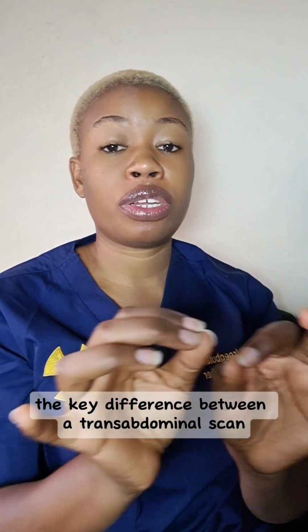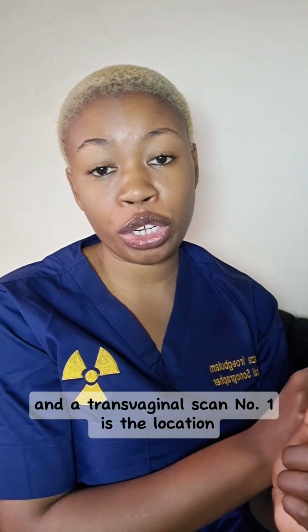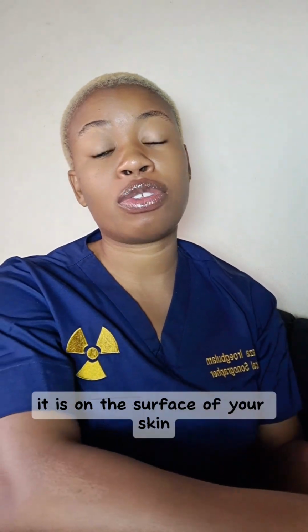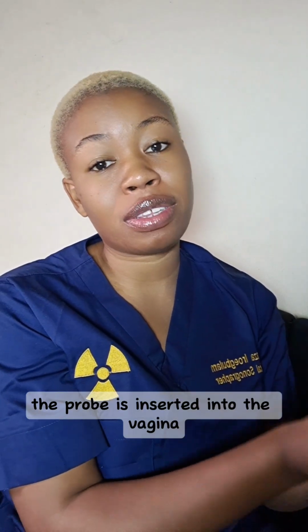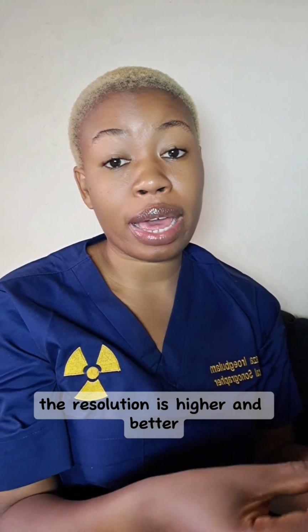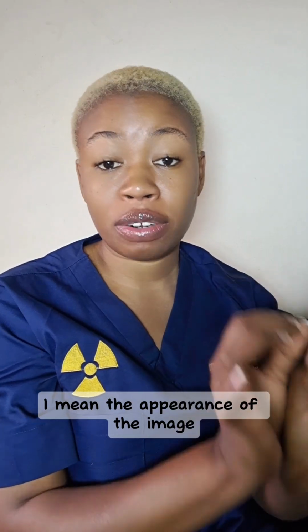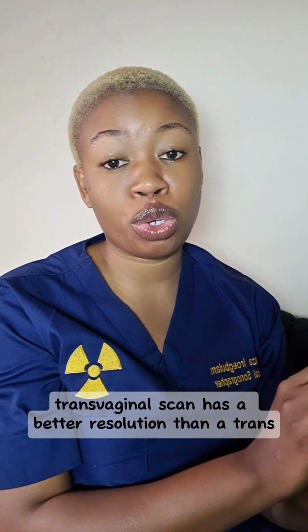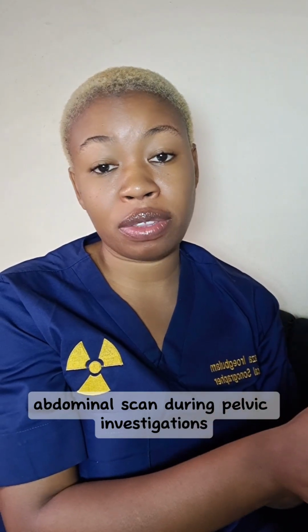So in summary, the key differences between a transabdominal scan and a transvaginal scan: number one is the location. For a transabdominal scan, it is on the surface of your skin. For a transvaginal scan, the probe is inserted into the vagina. The second difference is the resolution. For a transvaginal scan, the resolution is higher and better. When I say resolution, I mean the appearance of the image. A transvaginal scan has a better resolution than a transabdominal scan during pelvic investigations.